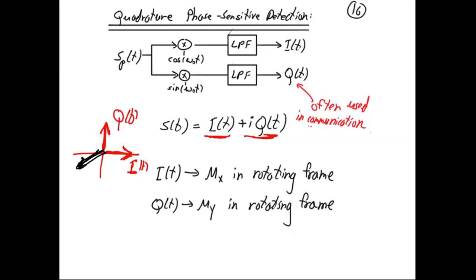Okay, so now we're finished with chapter 3. Next lecture, we're going to start covering chapter 4, which is physics. In chapter 4, we're going to pretty much derive the Bloch equation, which is a linear dynamic system that describes the dynamics of spins of the magnetization when you apply different magnetic fields on it: when you apply gradient fields, when you apply RF fields, and when you apply a B0 field.